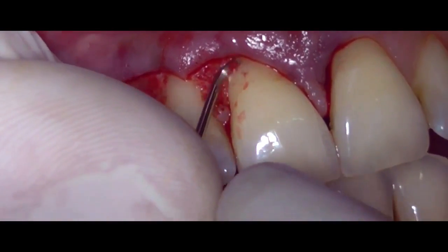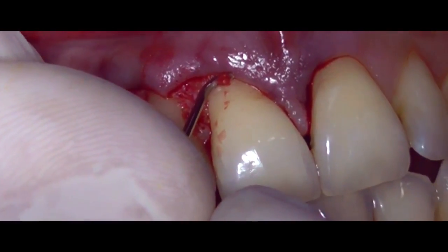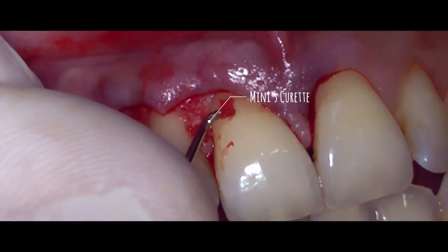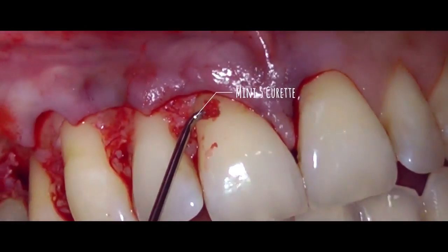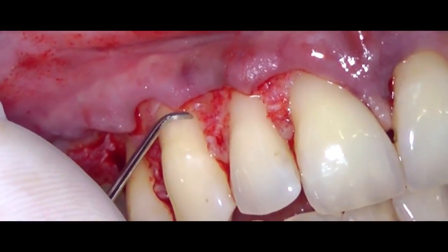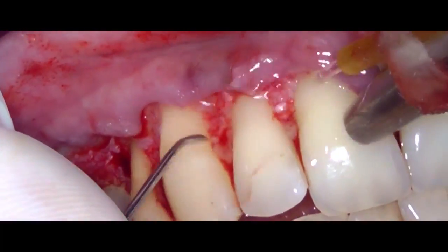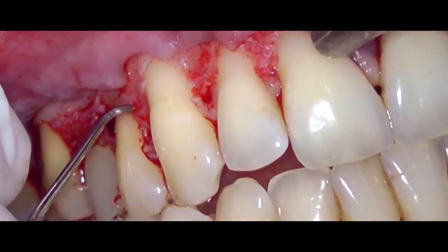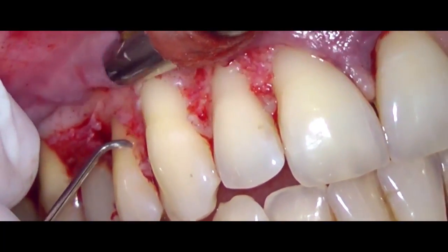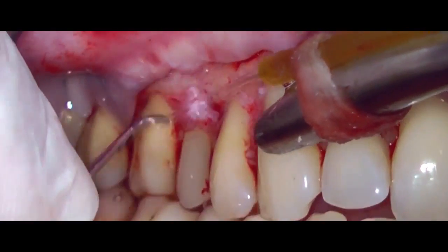You can see me now scaling the root surfaces. We use mini 5 curettes and attempt to keep the scaling limited to the area of the root that has been previously exposed. We don't want any damage to the precious connective tissue fibers that insert into the root cementum.